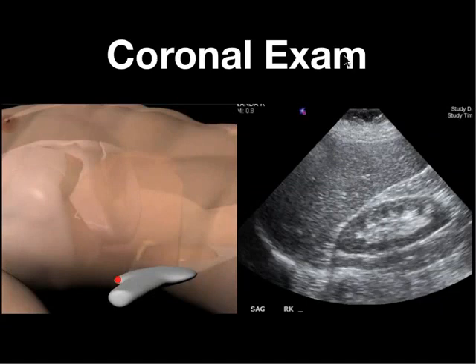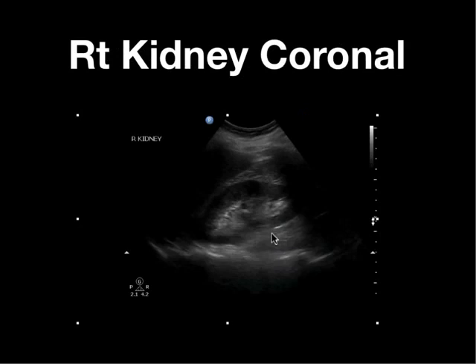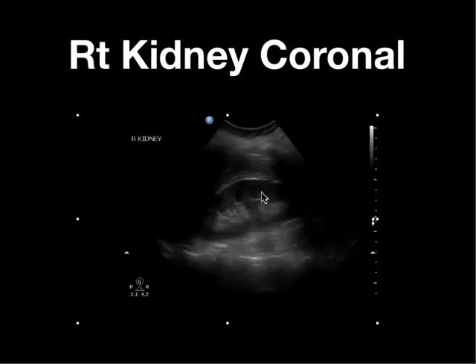The coronal exam will be familiar because this is what you do when you perform the peri-hepatic and perisplenic windows of the FAST exam. For the right kidney, the indicator is directed towards the patient's head, shooting from lateral to medial. You have the liver and the kidney — here's the renal parenchyma and the hyperechoic renal pelvis. The coronal plane is preferred because it allows you to follow the minor to major calyces into the pelvis and into the ureter all in the same plane.